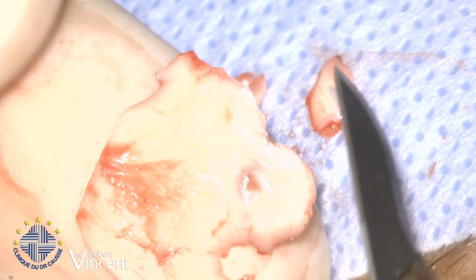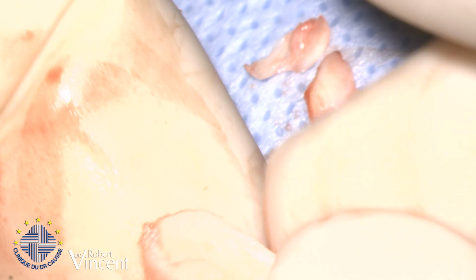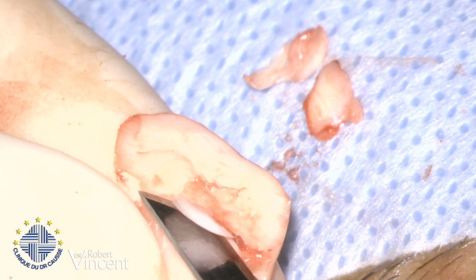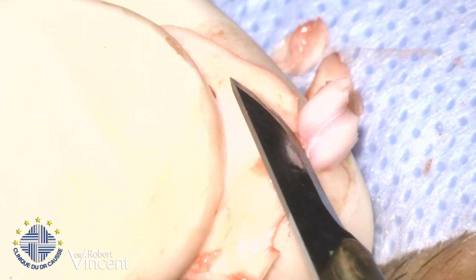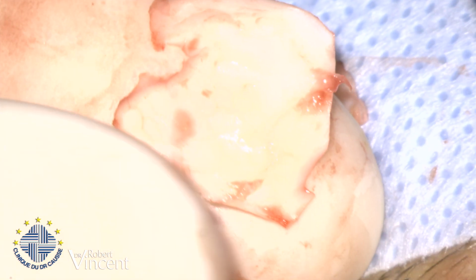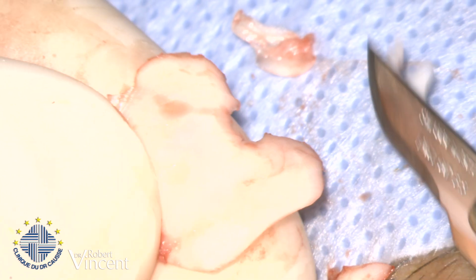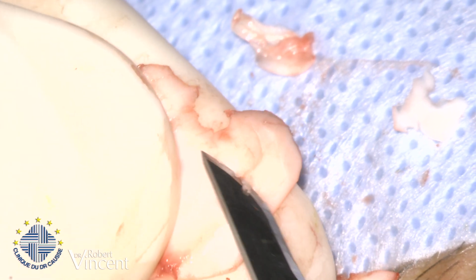It's becoming better now. Of course, it's too thick, too large. Maybe I don't need a perichondrium. I see. I like to do it like this, because I really control what I can do according to the different sizes. You can feel the blade on the other side. Yes, I can feel it with my finger. Sometimes you make it thinner, but it's not a problem because the whole thing is better now.